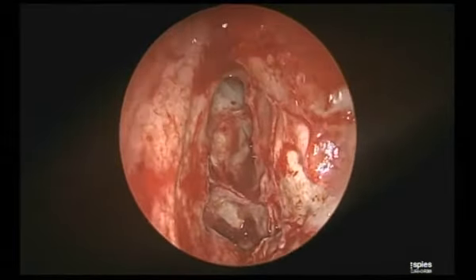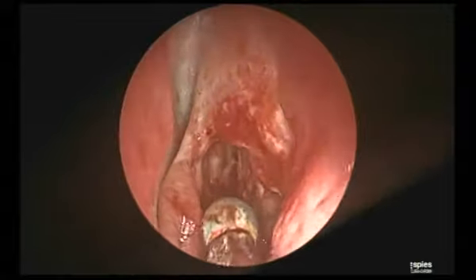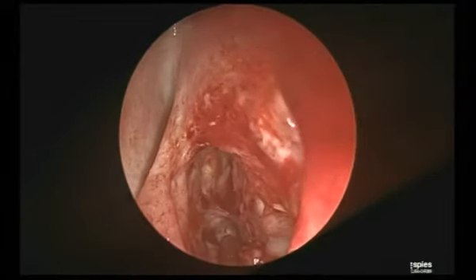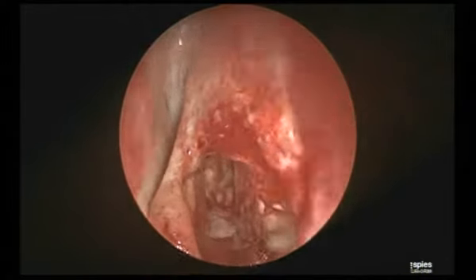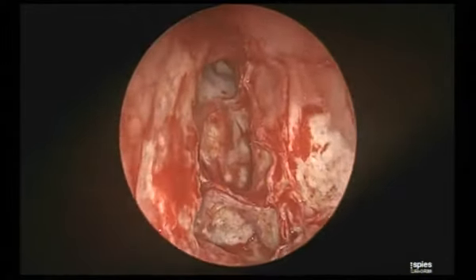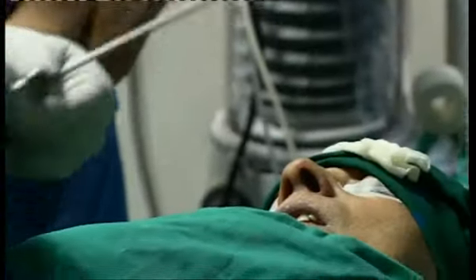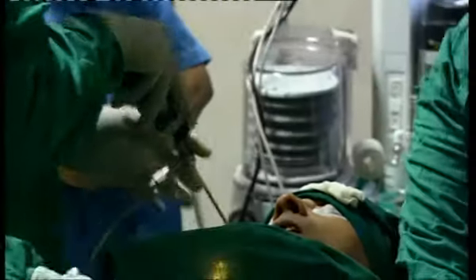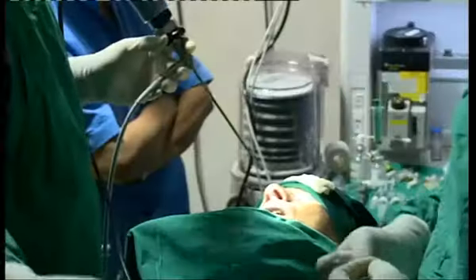The only constant way to find the anterior ethmoidal artery is what I am going to show you now. I told you the upper attachment of the basal lamella. That is to me the most constant landmark to identify the anterior ethmoidal artery. Now I am going to change to the 0 degree. Are you with me? So straight. Now I am changing to irrigation.